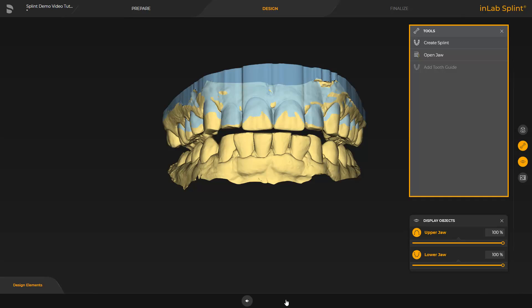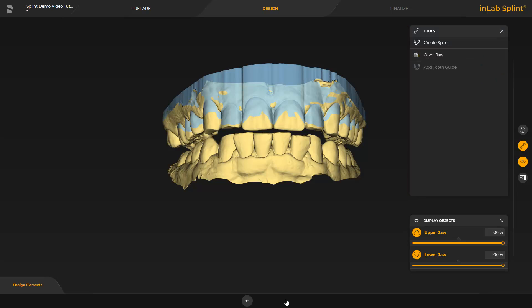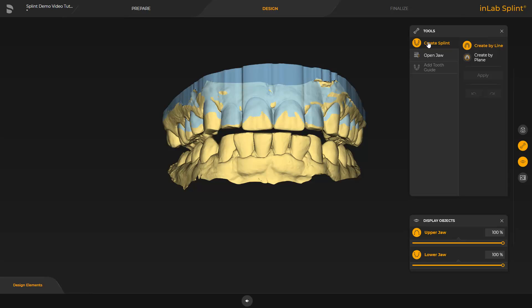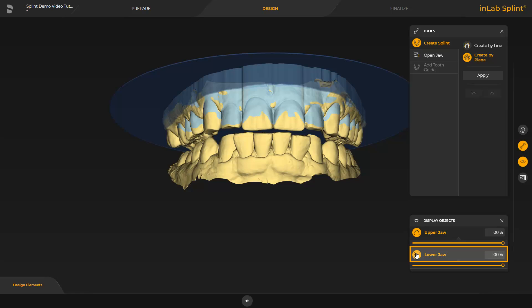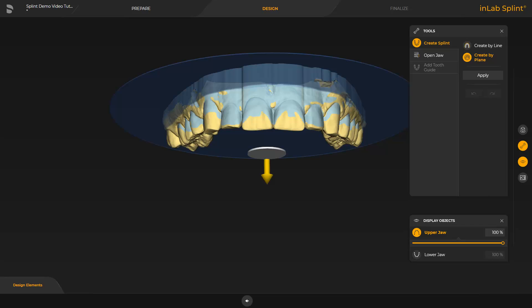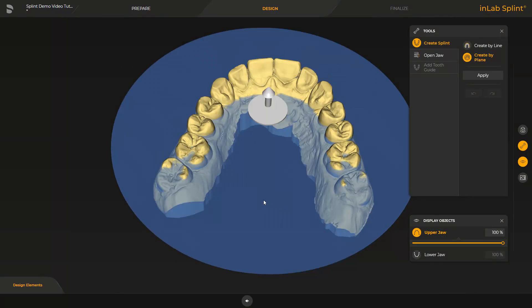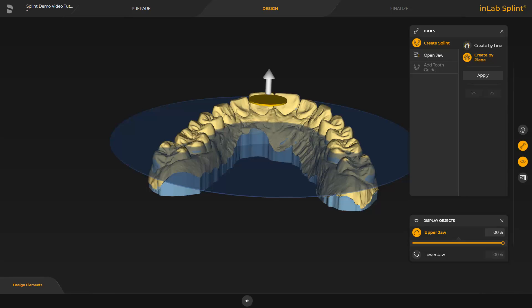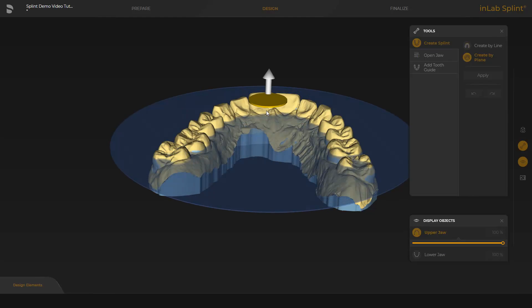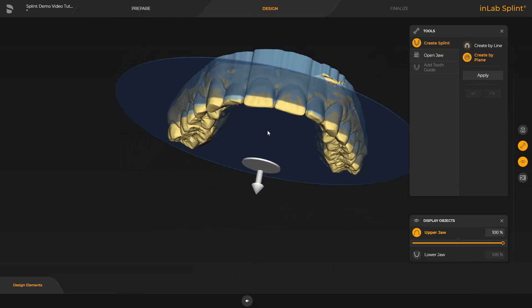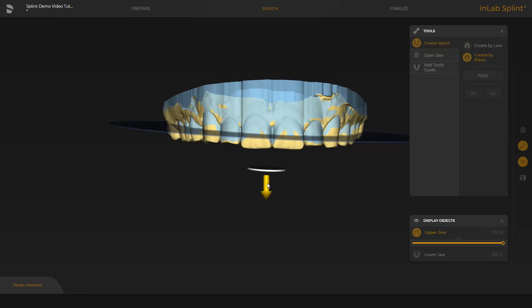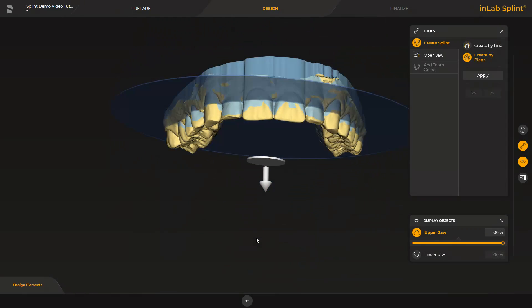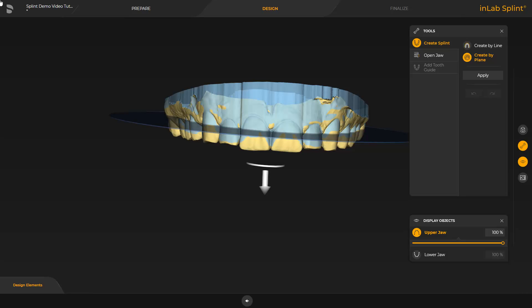The design phase contains three tools available which we are going to demonstrate next. First, we enable the create splint option. Here the splint contour can be set by drawing a line, or it can be adjusted with a plane that is displayed with the create by plane option. We disable the lower jaw and first move the plane using the yellow arrow. With the disc, the plane can be tilted. To finish, we confirm the position by tapping Apply.